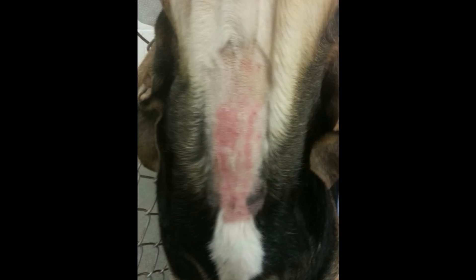Recall that at the beginning of this video the clipper was held at an improper angle. Here is the consequence 24 hours later: the dog has developed a significant rash, likely a combination of microtrauma from the clipper blade and the prep with soap and water. The dogs in this laboratory have extremely sensitive skin, so be very gentle with clipping, use soap gently, and thoroughly rinse all soap from the skin.